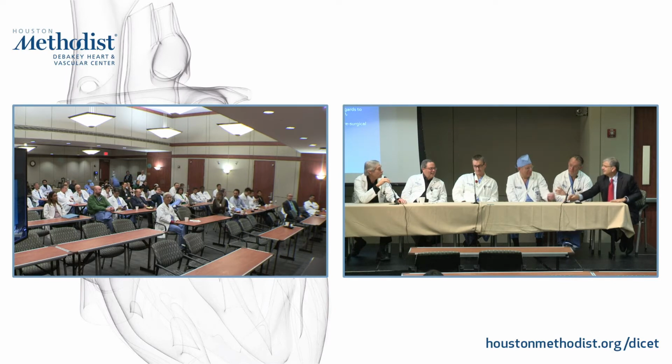But actually, the other thing I want to mention is, if you just want to see the valve leaflets and nothing else, you can do a non-contrast gated study, and you can easily see whether that's a dysfunctional valve or not. So you don't necessarily have to give contrast. If you want to look at the potential mechanism of why, then you need contrast. But just to look at a mechanical valve itself, you can just gate it to the EKG like a normal gated study, and you'll see the leaflets open and close, just like you would on fluoro.